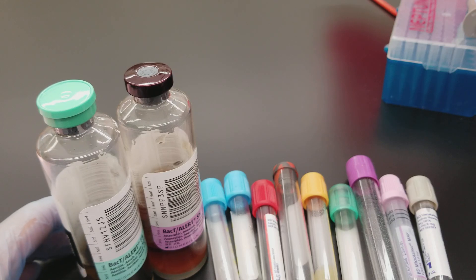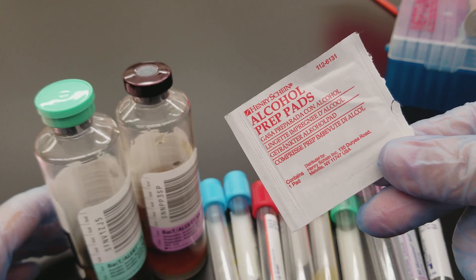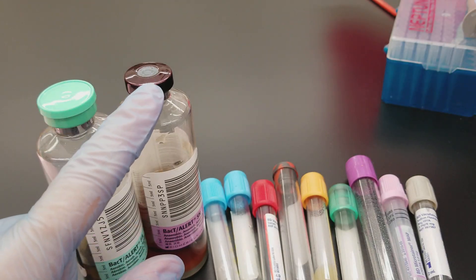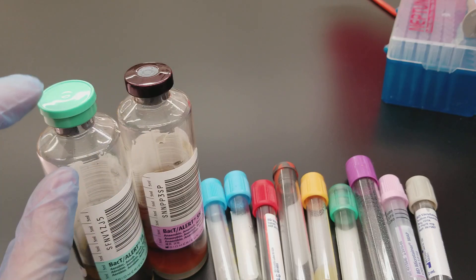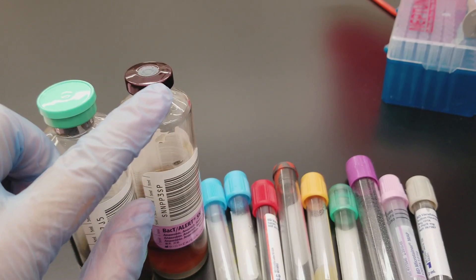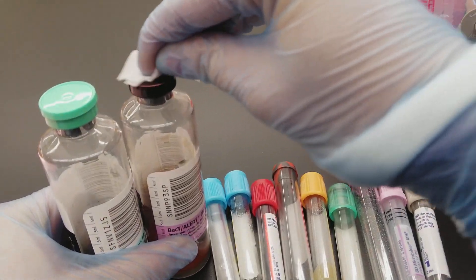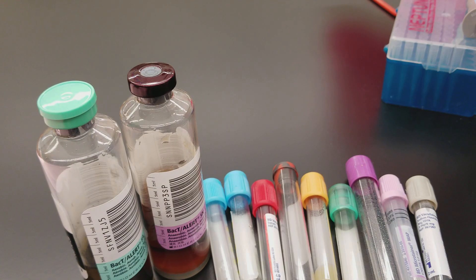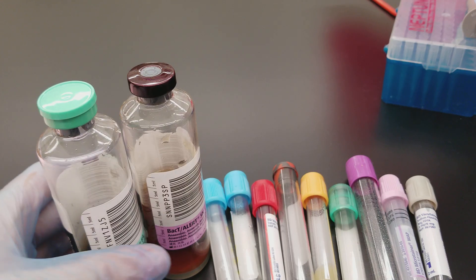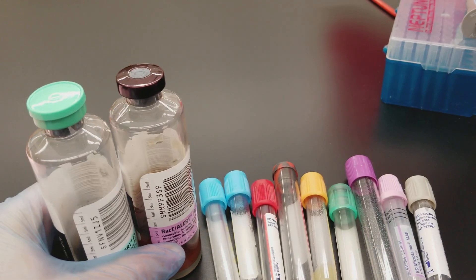That way we can get a purified culture and figure out what the patient is actually suffering from and the best way to treat them. When we draw these, we want to use an alcohol prep to cleanse the site on the receiving end of the vacutainer. We would use an alcohol prep and let it air dry. Do not blow on it, don't wave at it — you don't want any environmental bacteria to get on there. Then we would put the vacutainer needle in and start the draw.